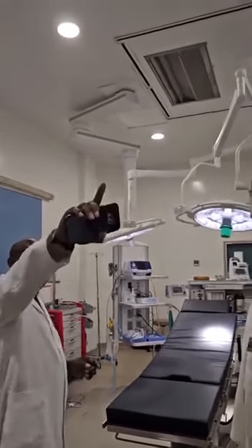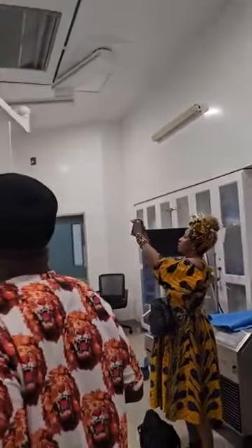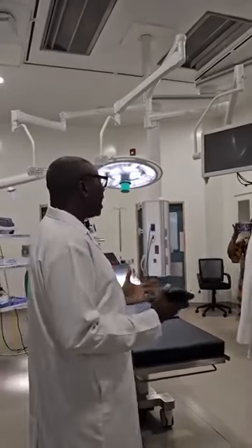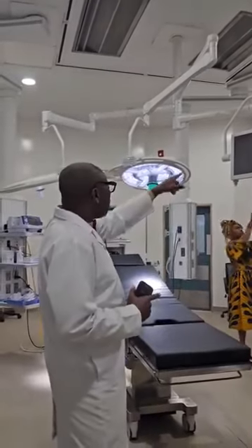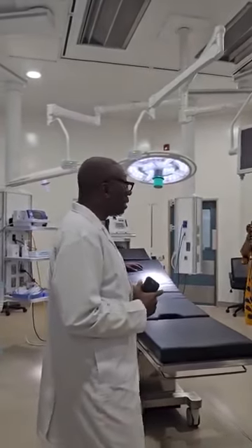And then you have this monitor here. So when they're over here, instead of the bed, they can see all the hemodynamics. They can also see the perfusion there, and they can also see it on this one. So you have 3 points, and this one sends data while you're operating in real time. We can transmit data through here. So if you have a surgeon in Lagos who's an expert in something, and our people say, fine, we want you to participate, he can log in, look at the monitor and say, I think what you are looking at may be this or that.